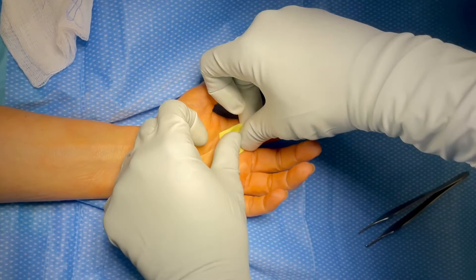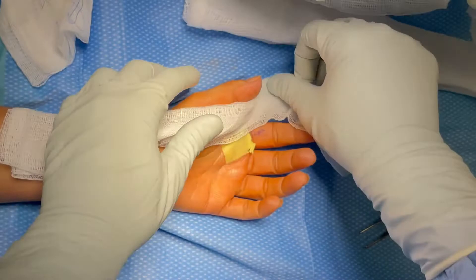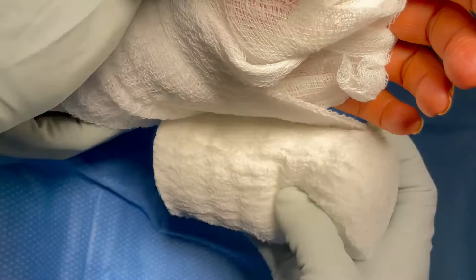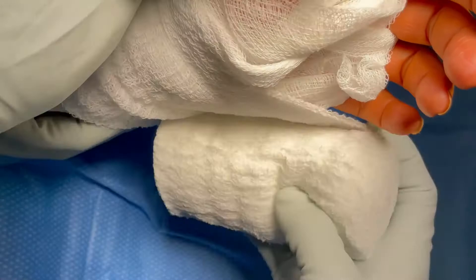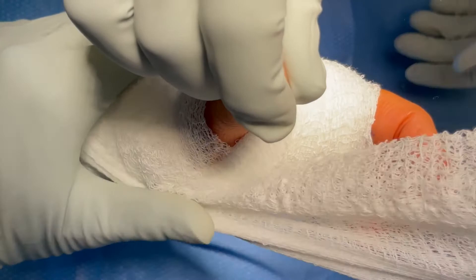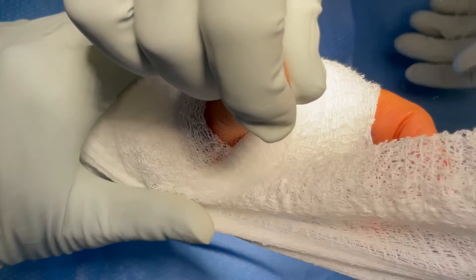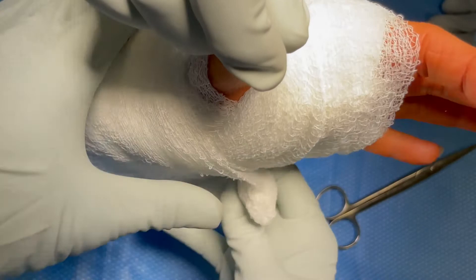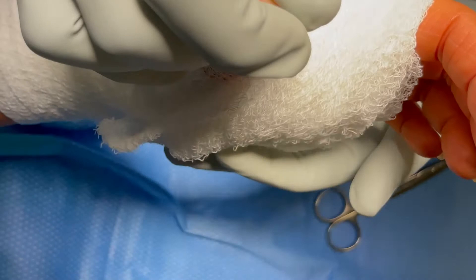We've placed a Xeroform dressing, which is a Vaseline gauze with bismuth. Then we're putting gauze between the fingers to prevent maceration of the skin. We then apply a Curlex roll — a gauze in roll form — which absorbs any bleeding and adds even pressure around the hand to prevent swelling. We then secure this with a Coban dressing, which is self-adhesive and sticks to itself but not to the patient's skin.